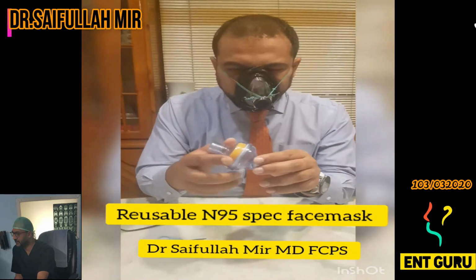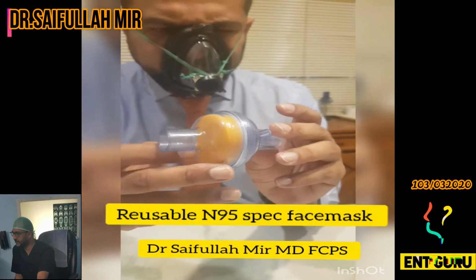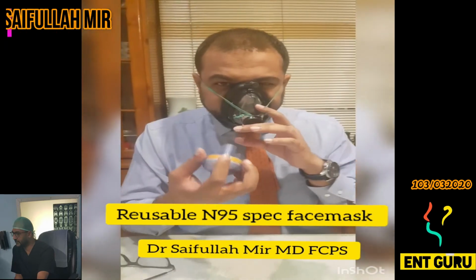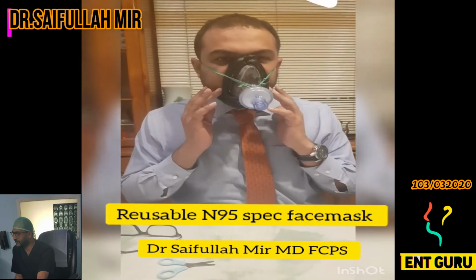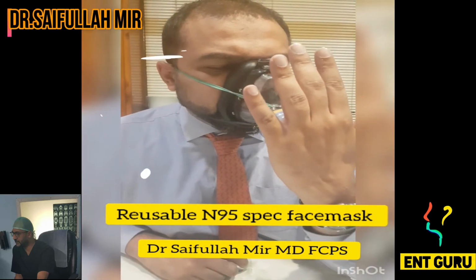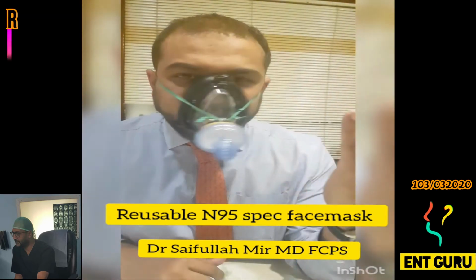Now we'll put the filter on. The yellow side will go in and the white side will go out. As soon as the airtight seal is made, my voice will go down. As you can see, it's an airtight filter. You check for the seal. For the seal, when I try to inhale, I can't inhale.